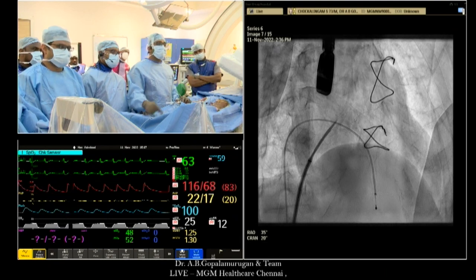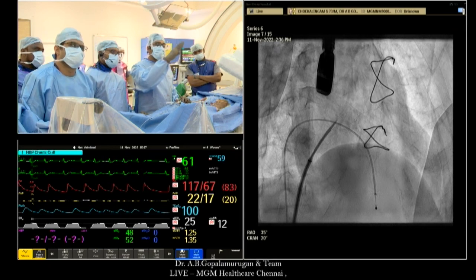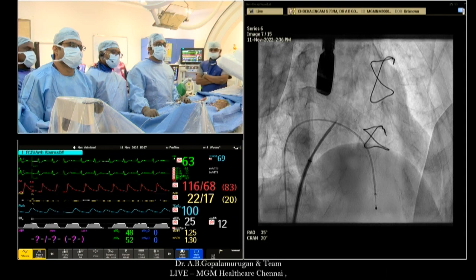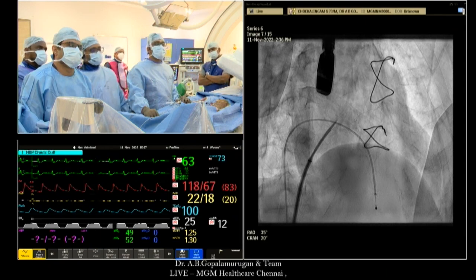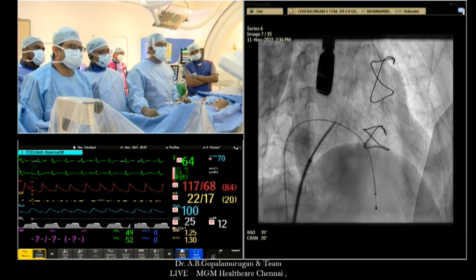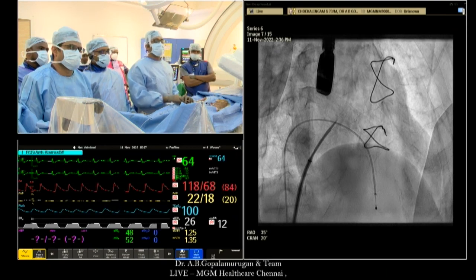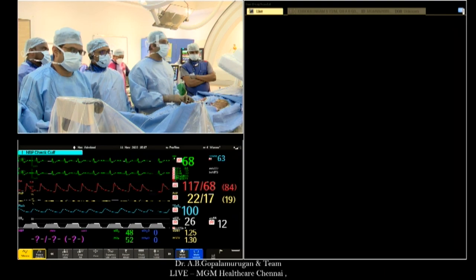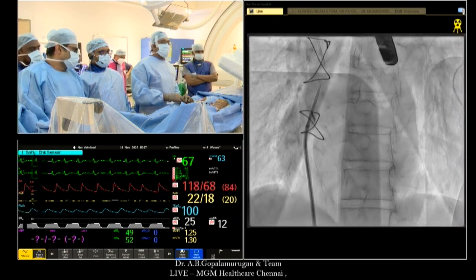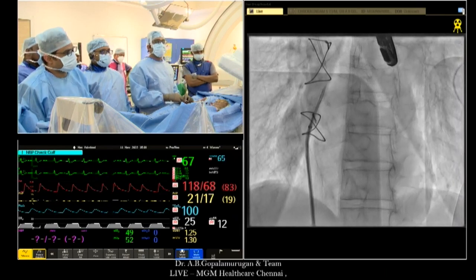Yes. Now, the idea is to try and get an inferior and posterior puncture so that you get a very straight trajectory into the valve. That's proving difficult because this left atrium is huge. It measures about 9 centimeters on CT and on echocardiogram. We're going to show you the echo pictures, where you will appreciate why we are struggling to get a transseptal, but we will get there eventually. TOE. So we're in a bicaval view. I'm trying to drop here.